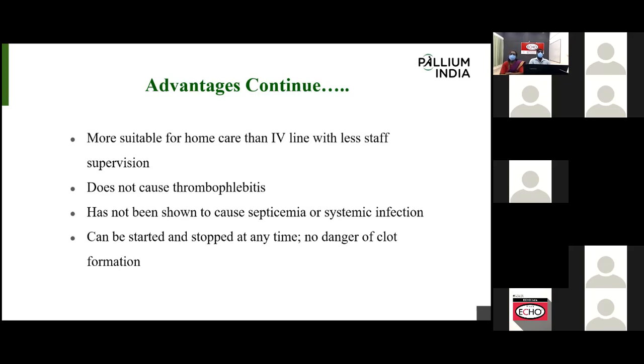Then if we give any bolus injection intravenously, for example, today morning we gave a bolus of injection, and the next bolus we need to give the next day or after 24 hours, we may lose the patency of the IV cannula, or the cannula becomes blocked. So we cannot give again intravenously. But in the subcutaneous route, such difficulties will not arise because it is not directly involving the bloodstream. So there is no clot formation in the subcutaneous site or needle. So at any time we can restart or stop the infusion and injection subcutaneously. It's one of the main advantages and it's easy to give.